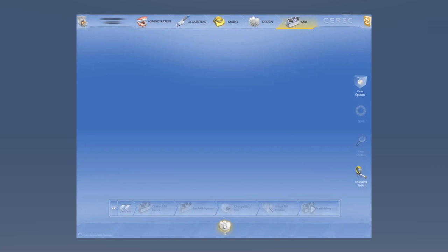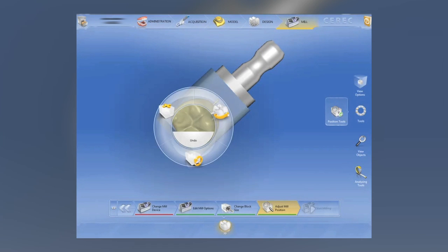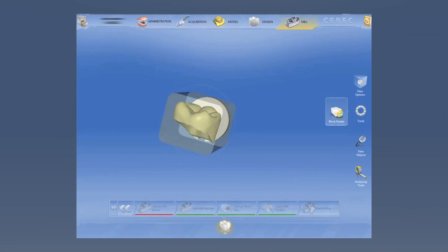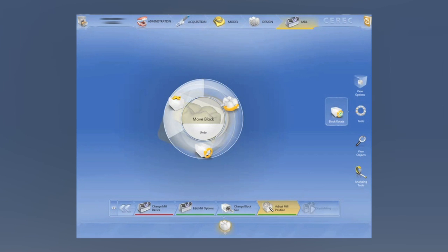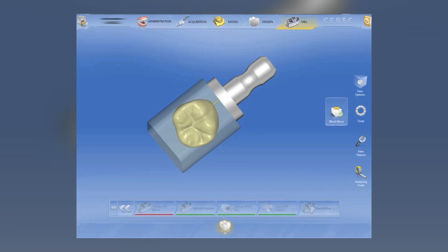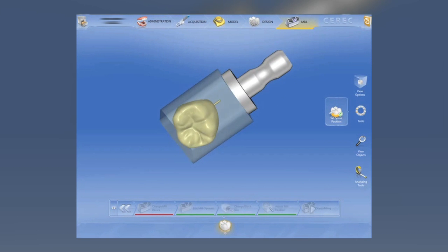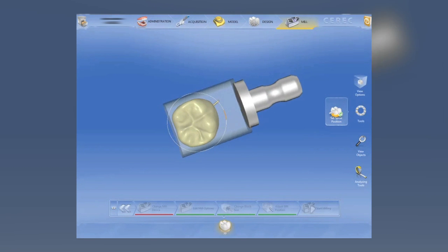Once we get into the mill preview, we have some new features here as well. We can actually put the sprue on the restoration anywhere we want to. We have the ability to rotate that restoration in the block — mesial, distal, buccal, lingual. Not such a big deal for a posterior restoration, but for an anterior restoration, we really have the ability to fine-tune our translucency in that particular block. You can put the sprue anywhere and also rotate it, so you're not just limited to mesial, distal, buccal, lingual. This definitely comes in handy every once in a while.